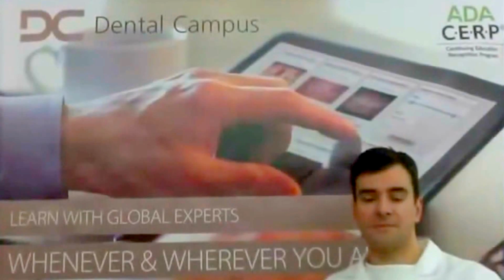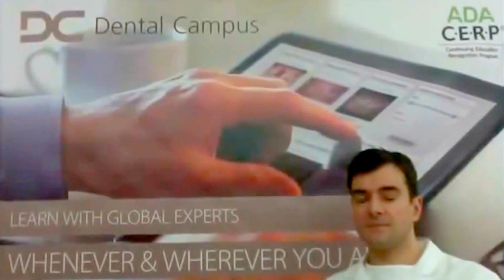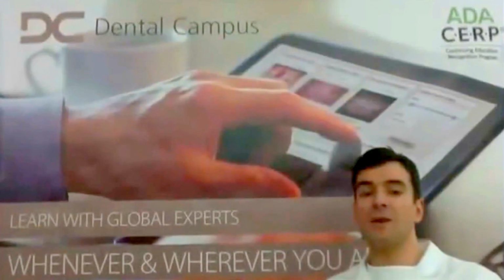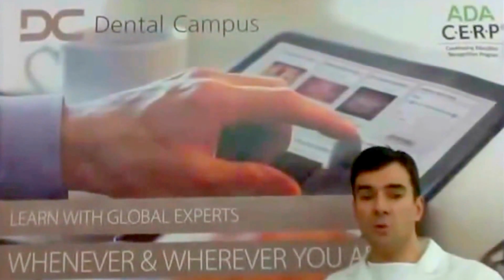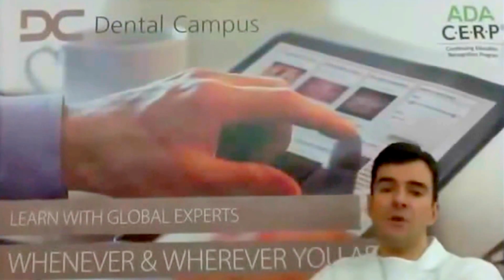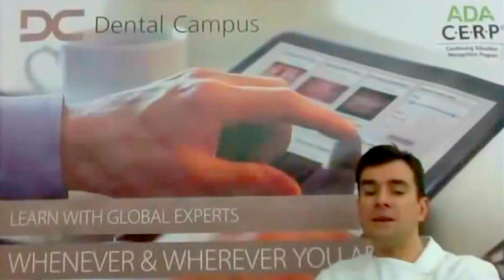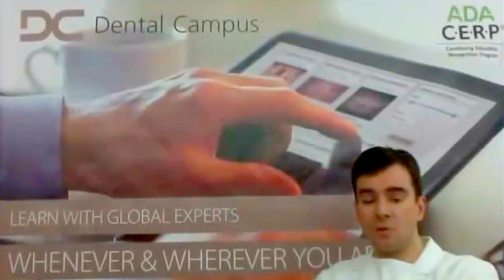A question about cantilevers. How predictable are implant crowns with cantilever? What do you prefer, 2 implants or 1 implant with a cantilever? So of course, the important question is how many implants are we reconstructing? If we have 2 or more implants, then I would say with a cantilever there is no problem at all. We know from the literature that there is a minimally increased amount of technical complications, in particular screw loosening.